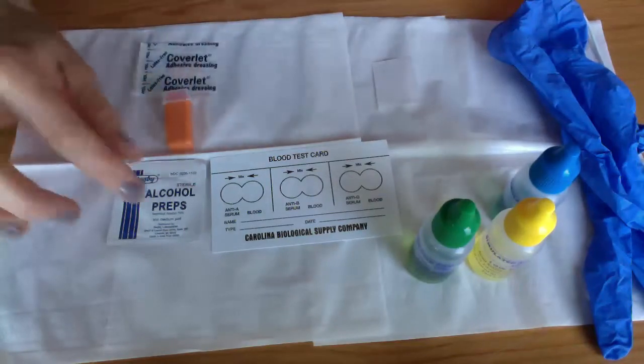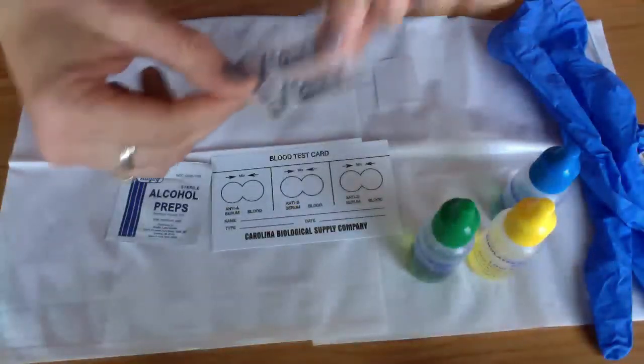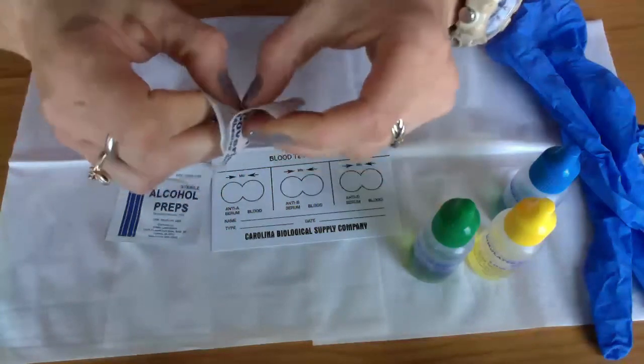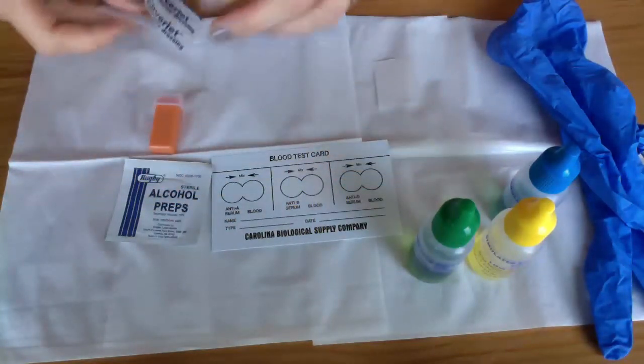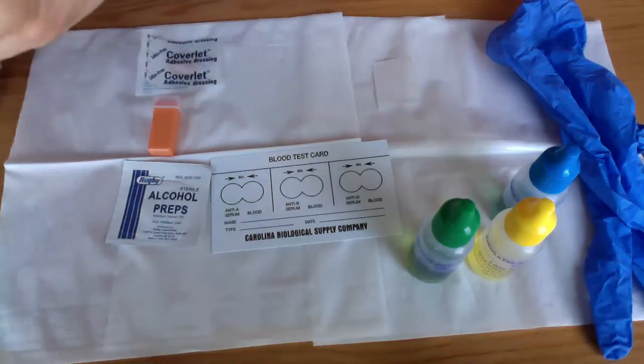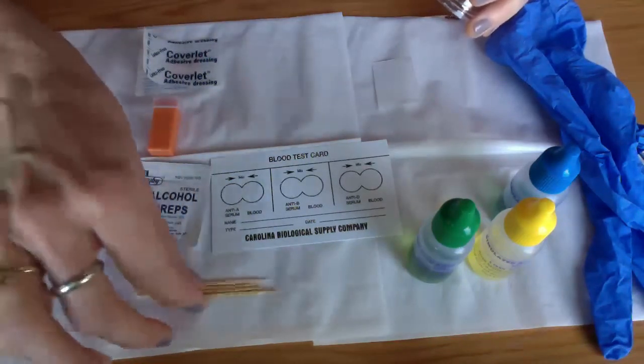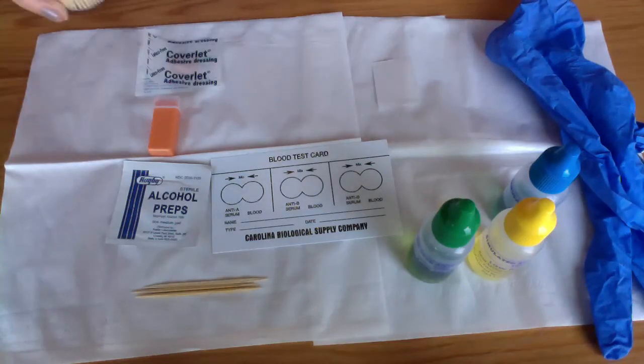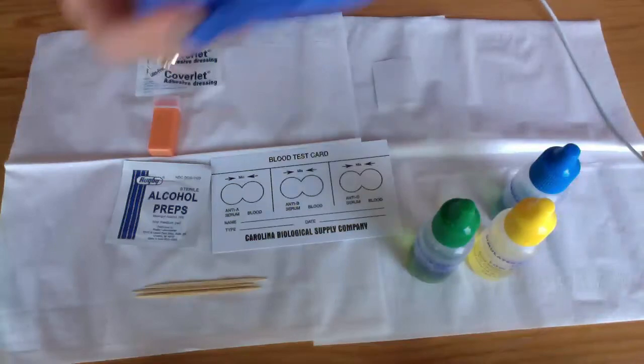I've got my blood typing card, an alcohol prep pad, my lancet, and my Band-Aid, which I'll go ahead and open so that I'm ready to use it. I also am going to use three toothpicks so that I can mix the blood with the anti-serum. And lastly, I have a glove.